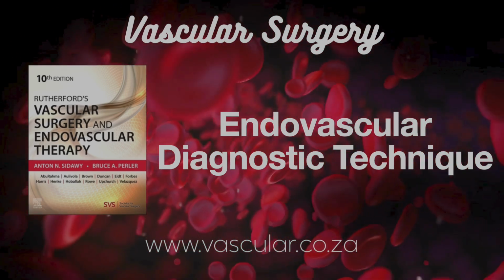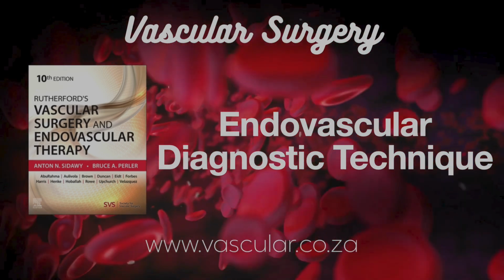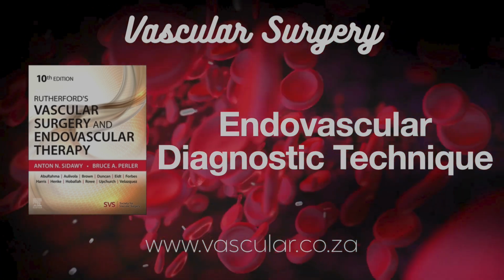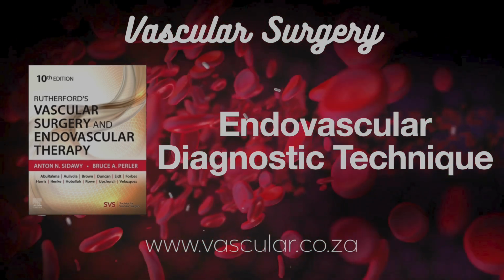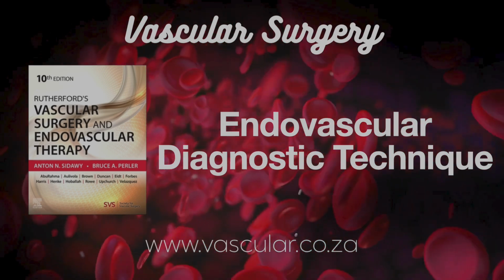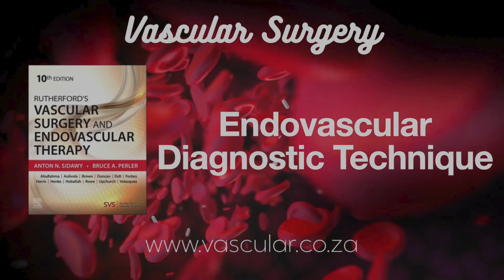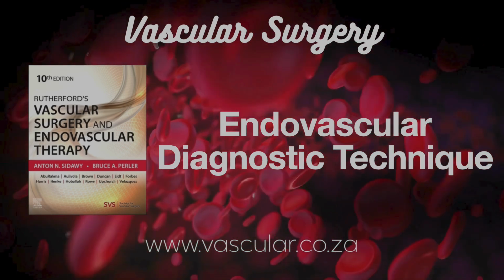Okay, moving down to the legs. Extremity angiography. First step is often that abdominal aortogram we just talked about. Get the overview. Then, 2 main ways to get detailed leg pictures. Method 1. Bolus chase angiography. Position the flush catheter at the bifurcation. Inject contrast, and then take a series of DSA images following the contrast down both legs as the table moves.